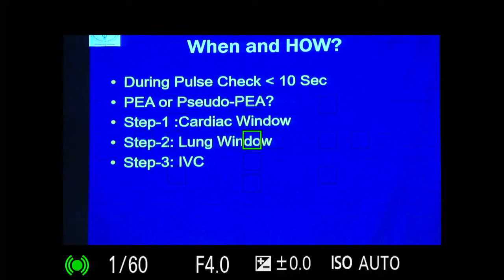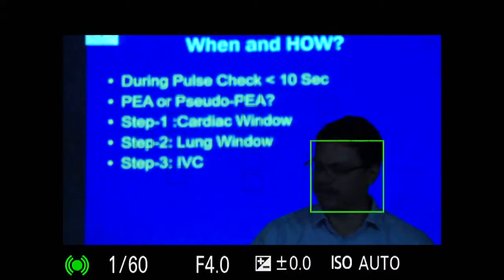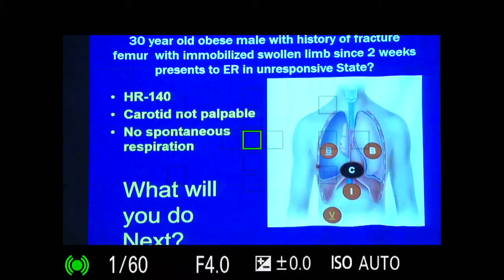It is 5th intercostal space. Okay. So, the 2018 guideline says it is changed. Okay. 5th intercostal. Except in pediatrics, it is still 2nd. Okay. So, if I do not find the answer, I will go to the IVC. What is happening with the volume status? Okay. So, this is how we are going to play, and we are going to play with 5 cases, right.